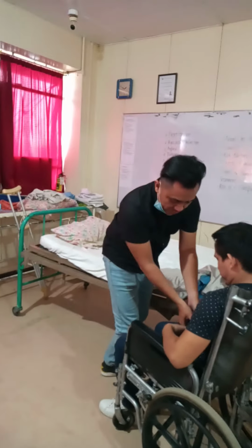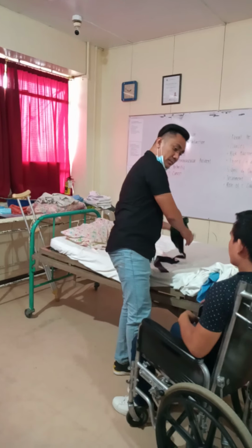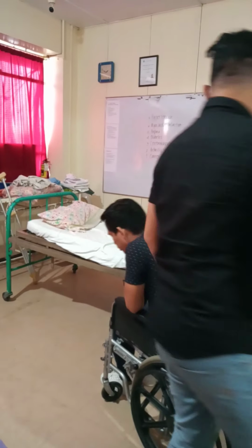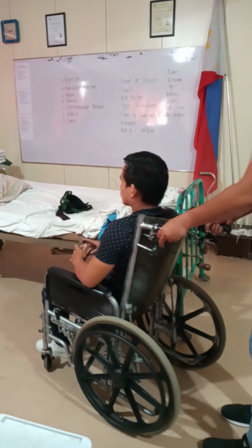Okay? Then remove the gait belt. Sir, he's not leaning back anymore? Not anymore. Okay, good. Then put both footrests down. Once you are ready to move, unlock both wheel locks. Then deliver the patient to where he is going. Do you get it? Yes.